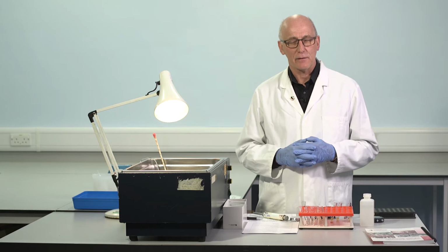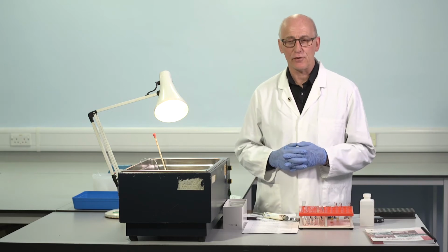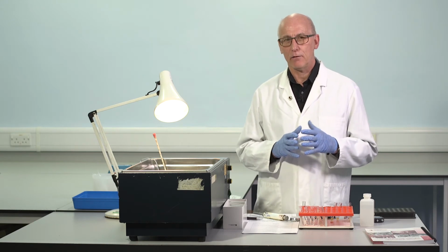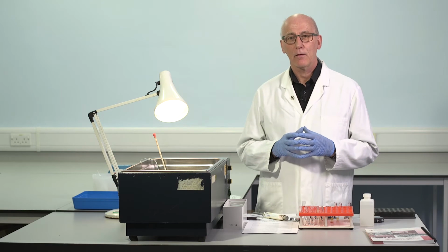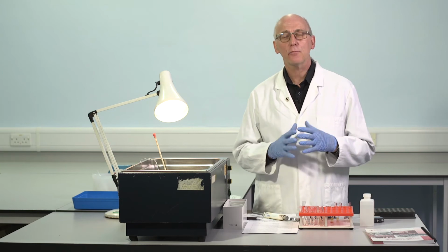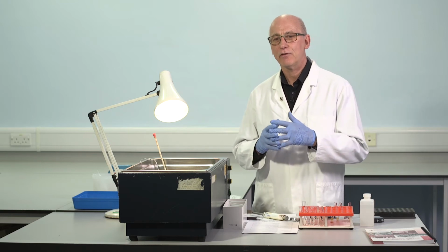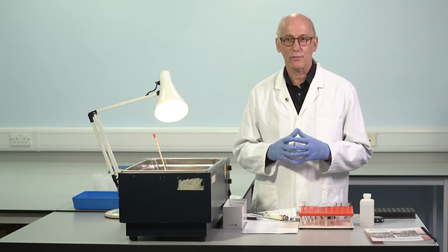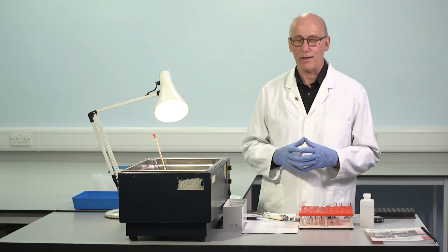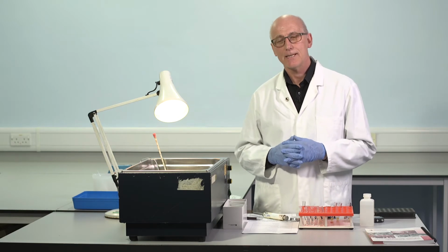We need this for several reasons, some of which we'll discuss when we come to the calculations and the plotting of results. We need this to be sure that we meet 2 critical criteria that confirm this is a valid assay. When we look at the relationship between clotting times and concentration, dilution, it should be a straight line relationship. And we can only establish that if we have done several dilutions. If we do 1 or 2 dilutions and we draw a line between, you know that a line between 2 points is always a straight line. So it gives us no information. We need to have 3 in order to confirm this criteria is met.